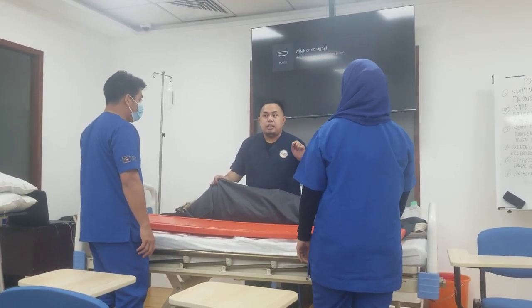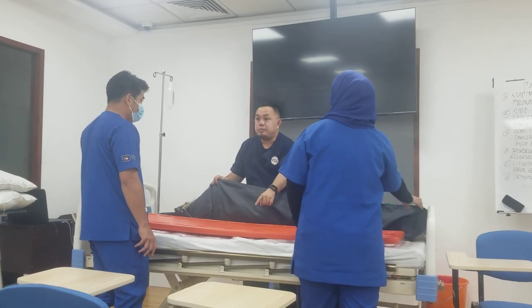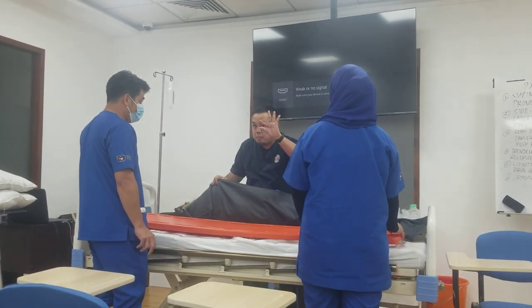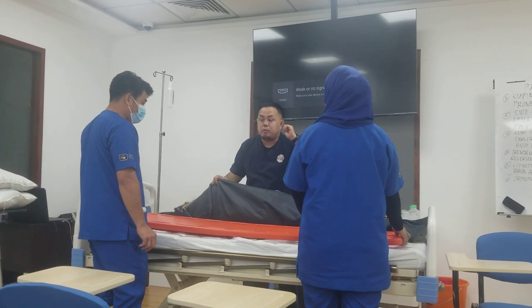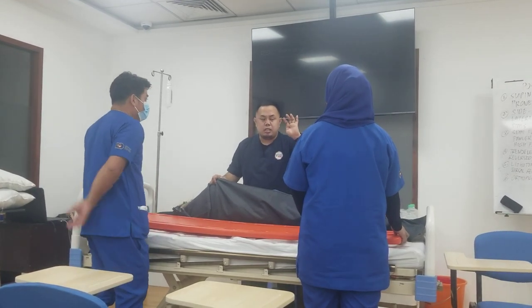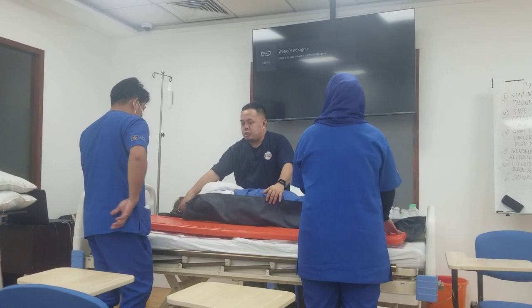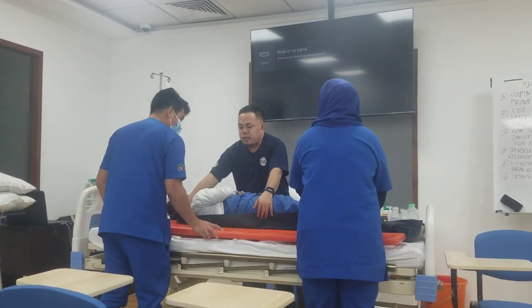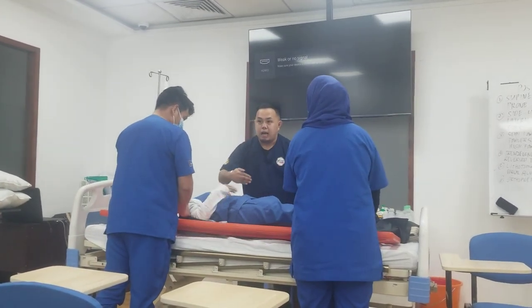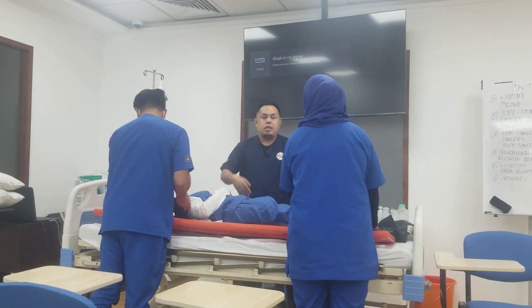You will now be sliding the patient from the bed to the board. Ideally the board is slim, as you can see in the video. Turn your patient toward the center so that half of the body is on the board and half is on the bed.